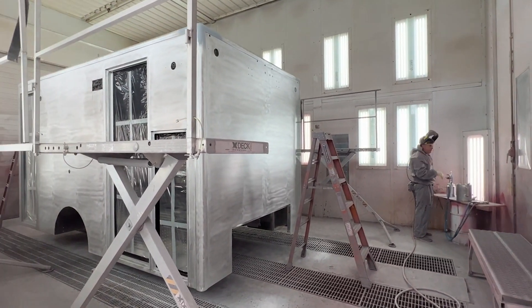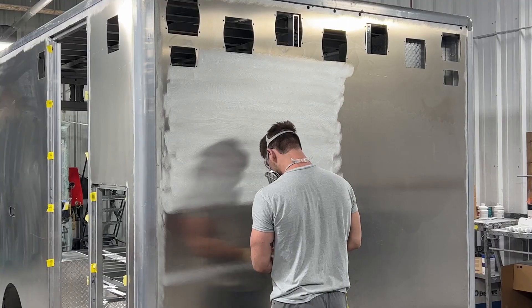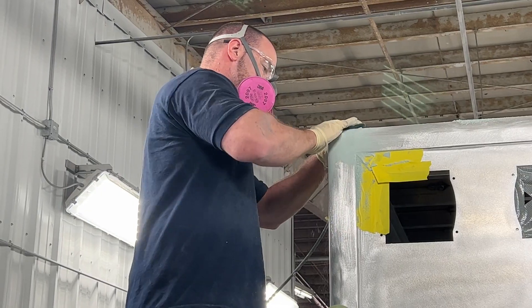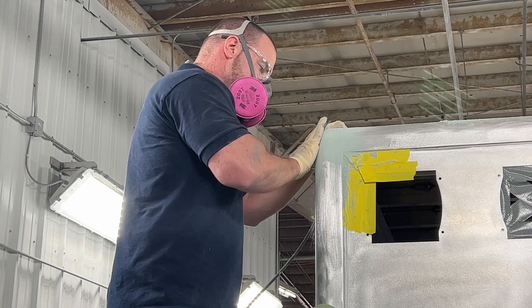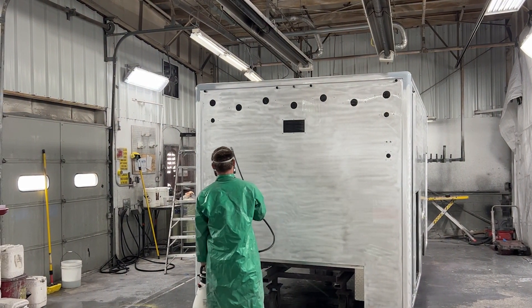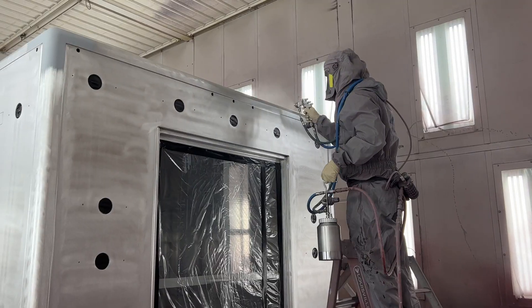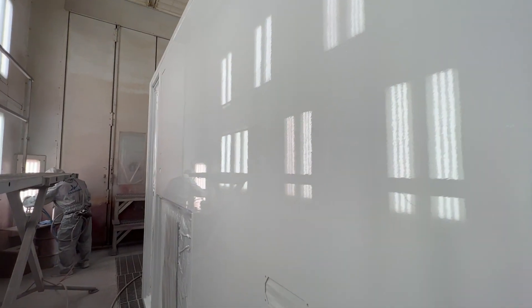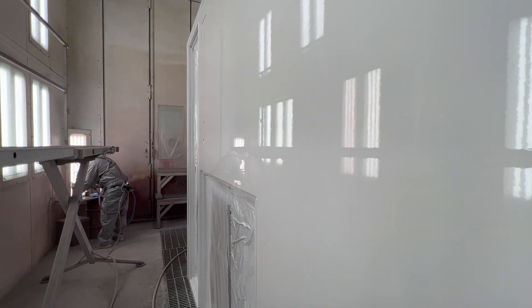Hi, this is Chad Nelson with PL Custom Emergency Vehicles. In this video, we will break down the process an ambulance goes through after fabrication and before it heads to the paint booth. Every step of the process is designed to combat the corrosive effects of today's environment and to make sure that the paint is applied evenly to provide our customers with the showroom finish they can be proud of.